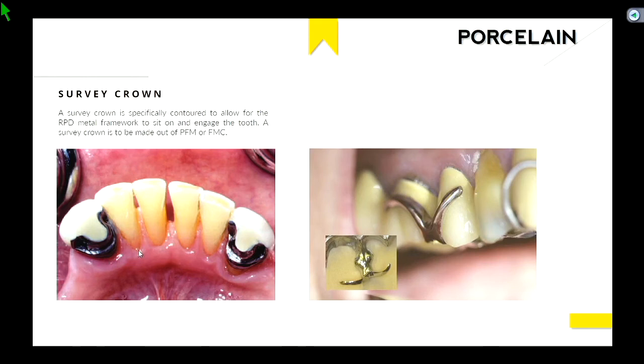But obviously the benefit is, well, you have teeth back there that you're trying to replace other teeth. So you have to strategically choose your abutment teeth, or the supporting teeth, so that you don't overload it. In this case, we're using the canines, and canines we know are the longest rooted tooth in our mouth, so that generally is a good abutment tooth. That whole discussion is maybe a little bit beyond the scope of this class, but something to understand.